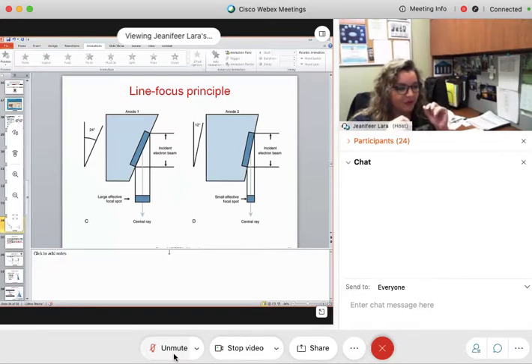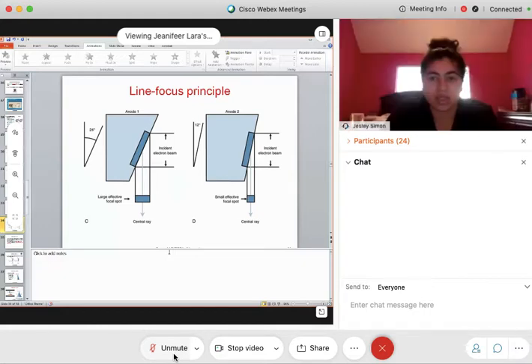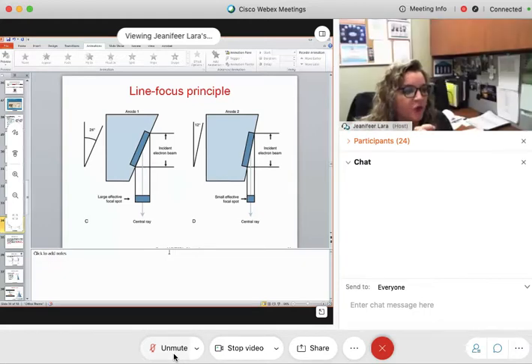Jessley, which one has the X-rays, the actual or the effective? Okay, I'm reading your lips. I think you said the actual? Actual is where the actual interactions take place. So it's the effective. E, effective, exit X-rays.